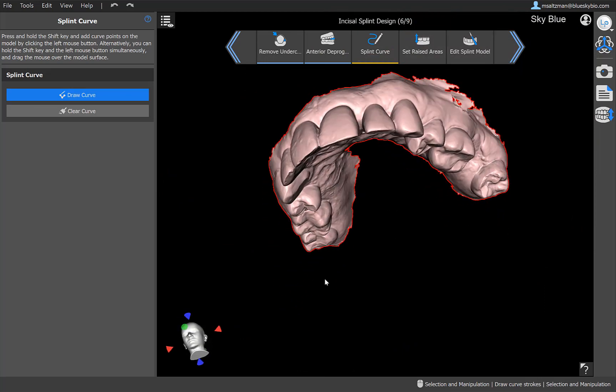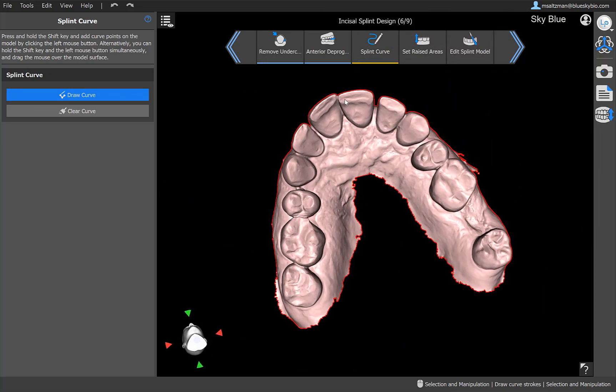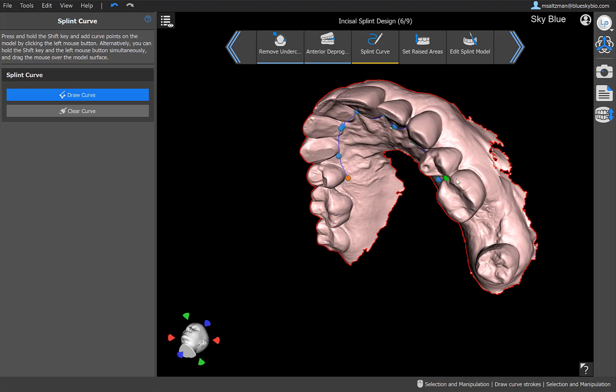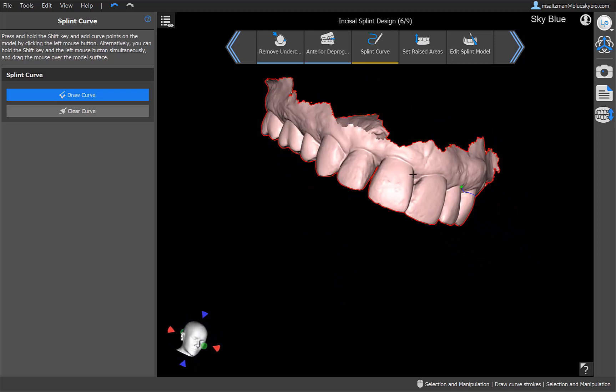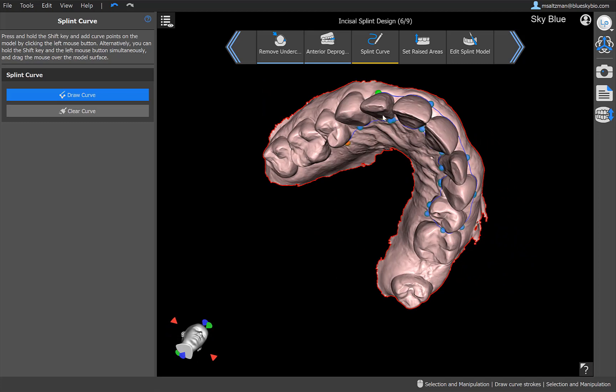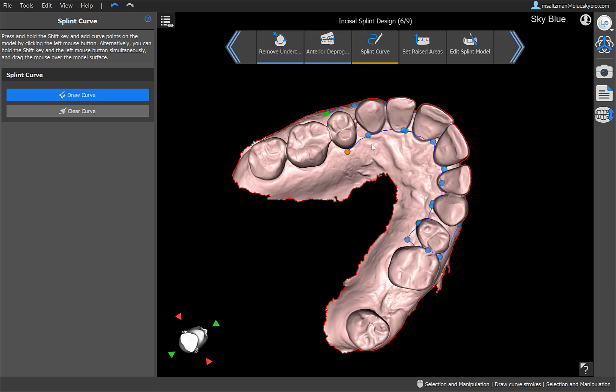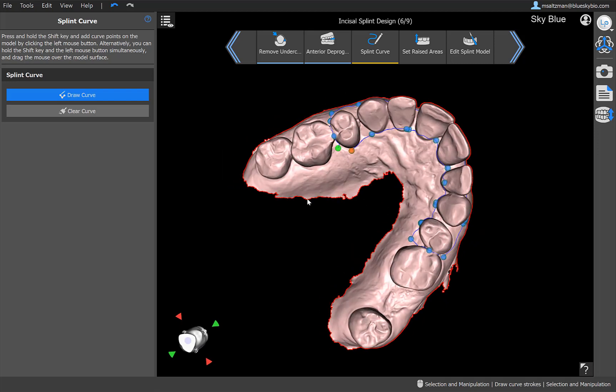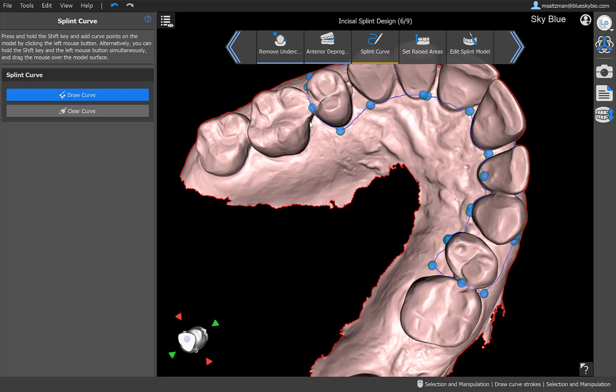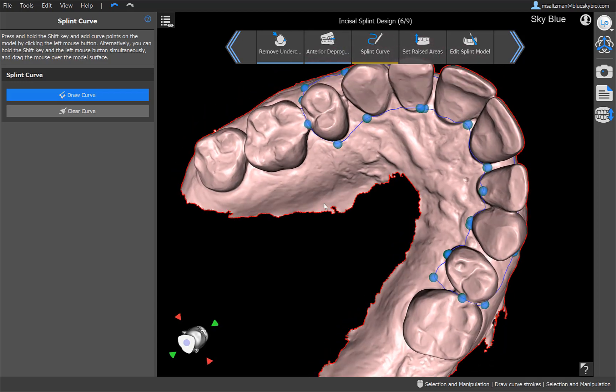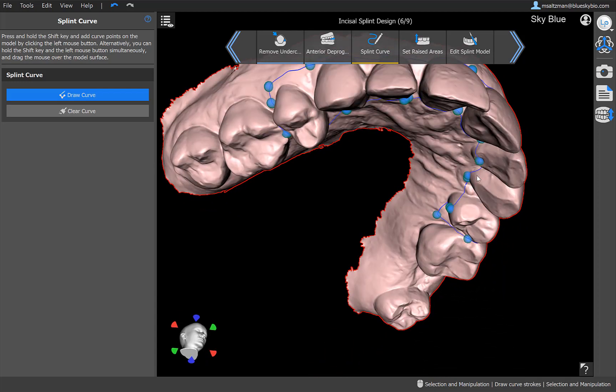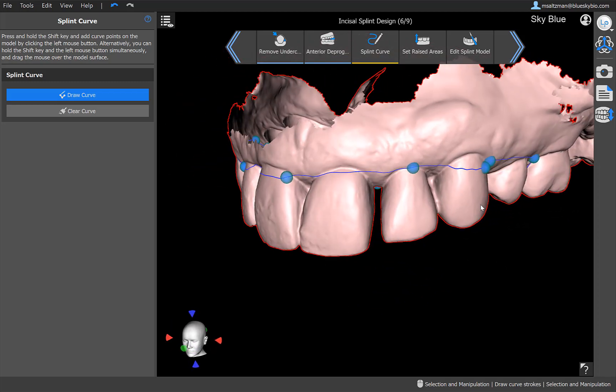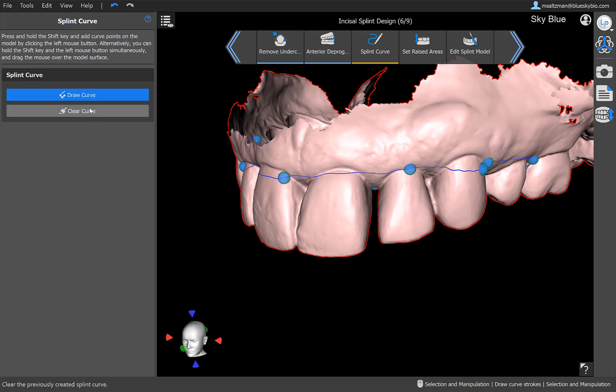So here we are actually drawing our splint curve. If we don't want to create an additional splint and we just want to work with the anterior deprogrammer, then that's fine. We could just click on next and move on to the next step. If we want to design that splint in addition to the anterior deprogrammer, then we could go ahead and draw the relevant curve. I'm holding down the shift key and left clicking to mark the points. And if I want to rotate, I let go of the shift key and just use my left mouse button. So of course, we go ahead and we close the curve. The green and orange dots that we saw when the curve was opened are now combined into a single blue dot. If we want to make any adjustments, then we could go ahead and edit the curve just by grabbing and dragging any of these dots. If we want to clear the curve, we have the clear curve button. Otherwise, we go ahead and click on next.